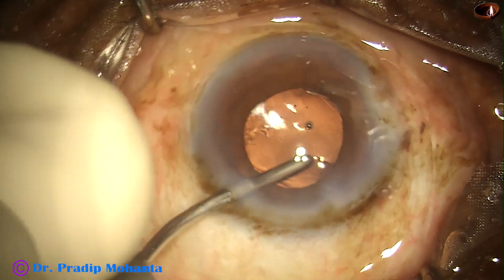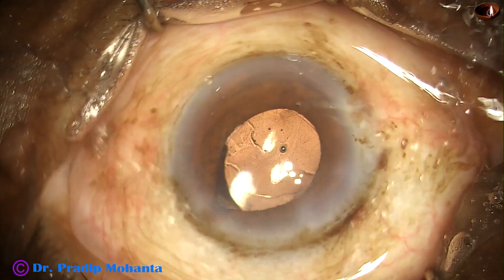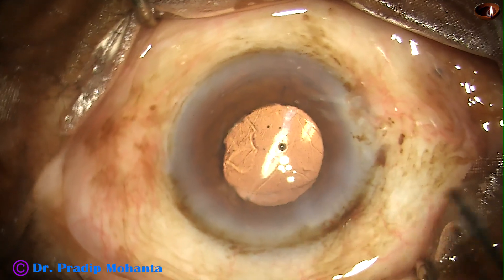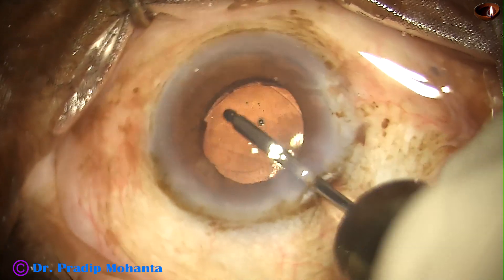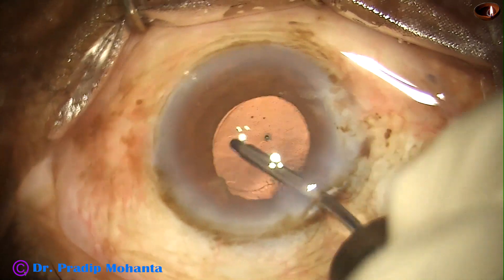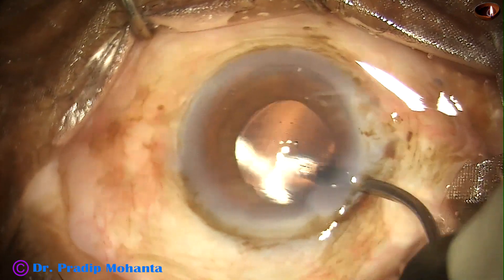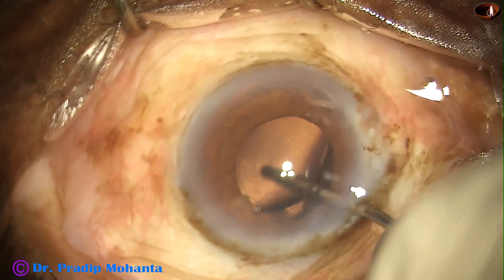I have no financial interest in the products or the equipment mentioned in this video. I am highly grateful to Apa-Sami Associates for all the help they have done in the past. They have now come up with beautiful instruments. The handpiece of the Galaxy Lio phaco machine is the lightest in the industry, at about 36 grams.